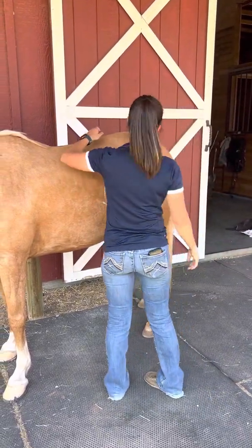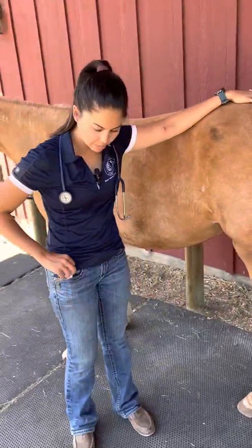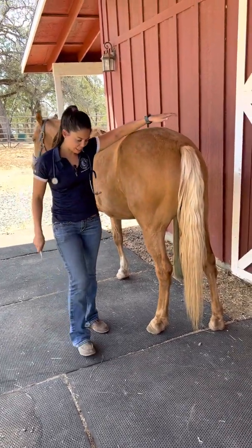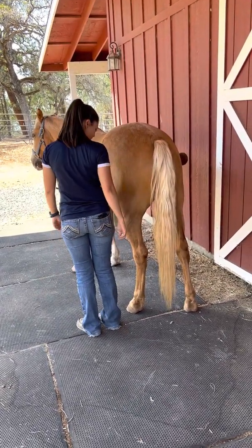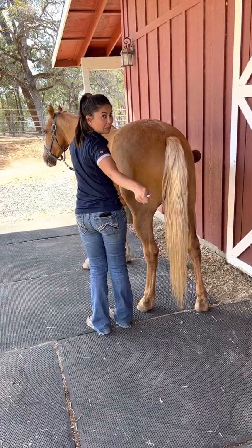Now to take a temperature, this is pretty self-explanatory. Most people can probably take a temperature, but can you do it safely? That's the question. If I'm standing here about to take a temperature, and I turn this way, if she kicks me, which way are my knees going to go? They're going to go that way, and then I'm going to break my knees.